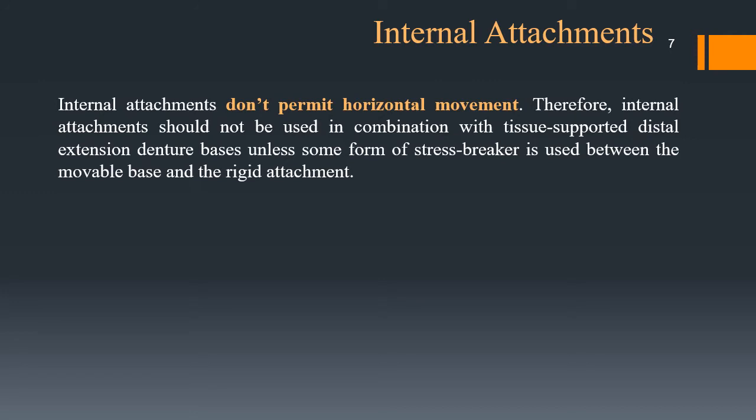Therefore, internal attachments should not be used in combination with tissue-supported distal extension denture bases, unless some form of stress breaker is used between the movable base and the rigid attachment.